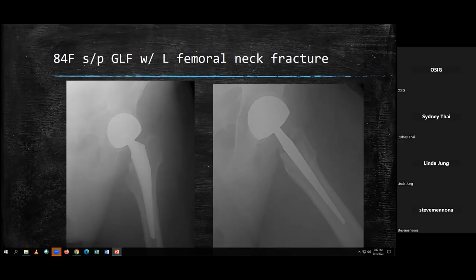So Joe, unlike Anna's case, where I saw screws that help lay down, what's holding that piece of metal in the bone? Prayer. No, so in this case, we're relying on what's called interference fit. So how you get this implant into the femur: we've taken out all the fractured, diseased area of bone, and then we use what's called a broach, which is a metal device that clears away some of the bone in the intramedullary canal, shaped just like this implant, and matches the size.